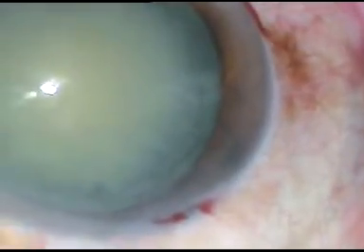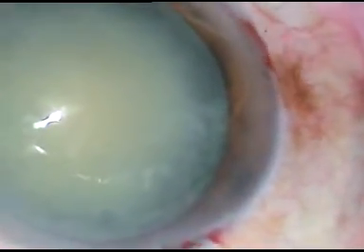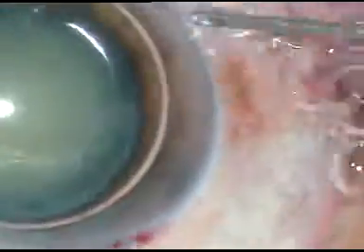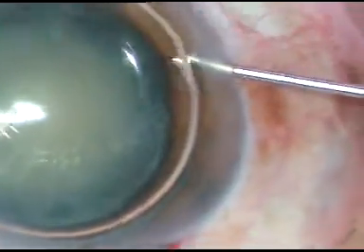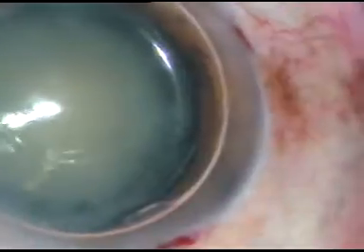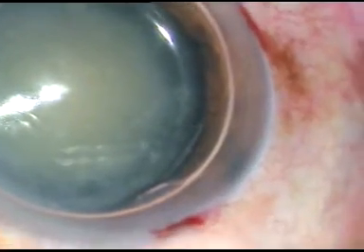Friends, this video shows how to play with the PHACO tip. This is a mature non-intimescent cataract. By this time, the main incision and on-side port has been made.